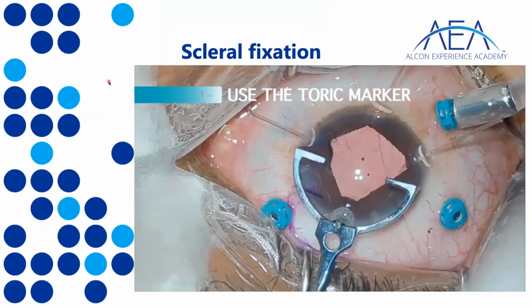So we will start with a small video here and see what we can describe. Now this is what's called the Yamane technique. It's a three-piece lens which goes through a tunnel in the sclera, but instead of being sutured or glued, it has a flange at the end which keeps it in place.